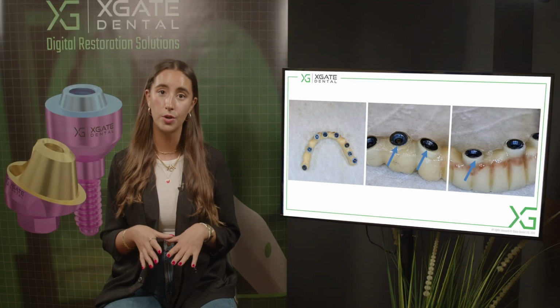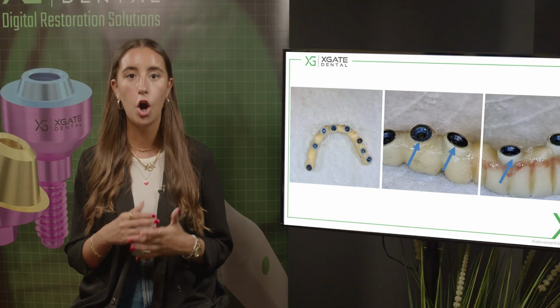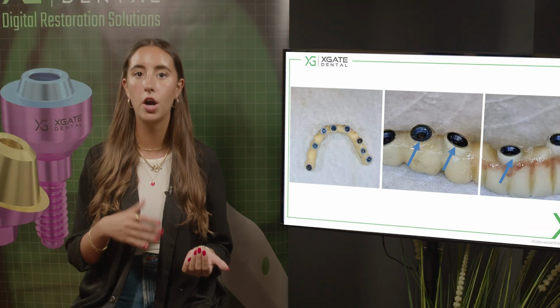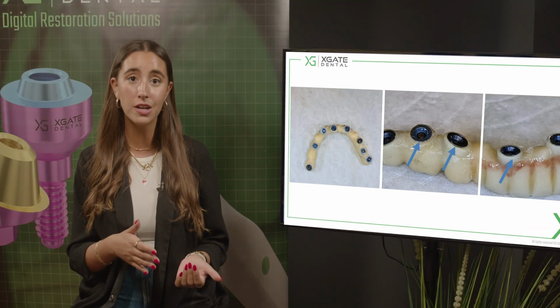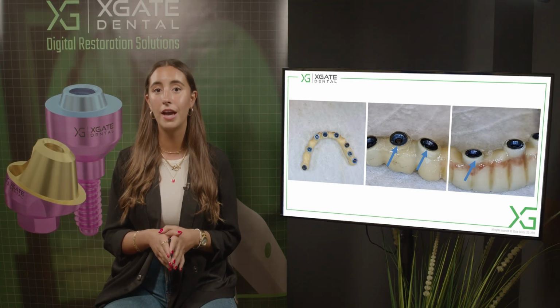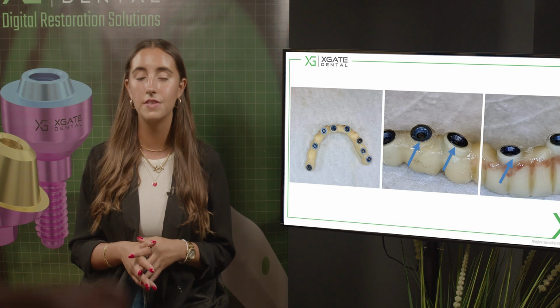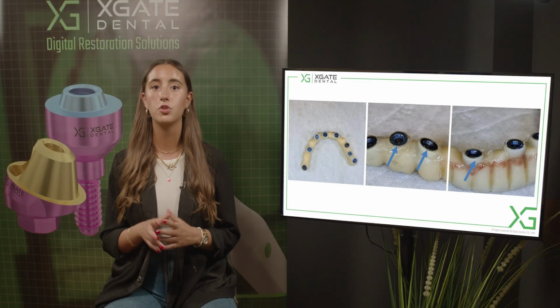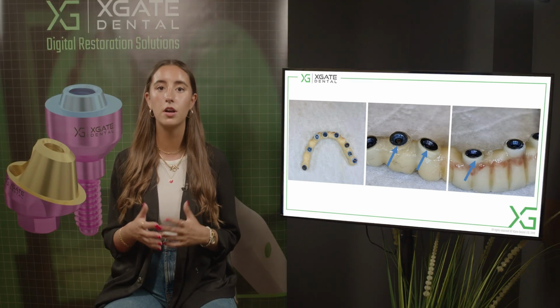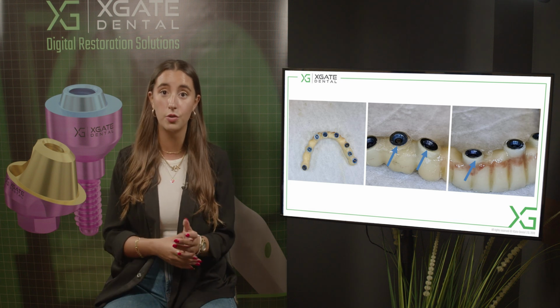Then we milled the zirconia, and then the cementing process inserted some deviation. All of these deviations are going one on top of another, and then in the final process, you get some part of inaccuracy. If you didn't do it in the same way, you didn't see this inaccuracy. You just had internal forces in the zirconia bridge. And then after 1 to 3 days, maybe a couple of weeks, the zirconia will just crack, and then you'll see 2 parts of the zirconia.